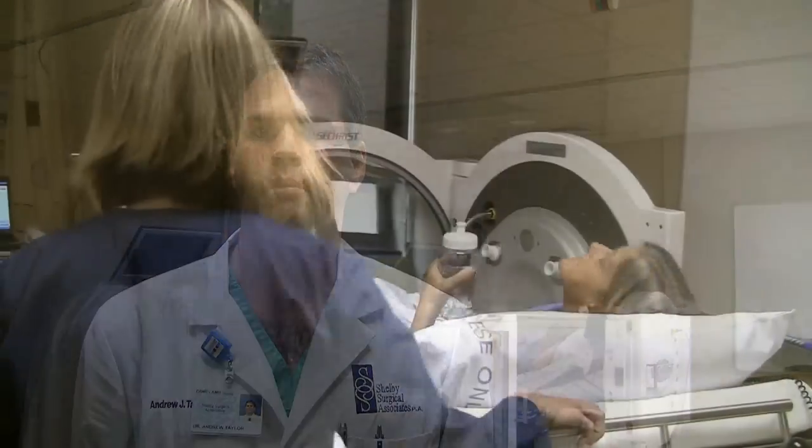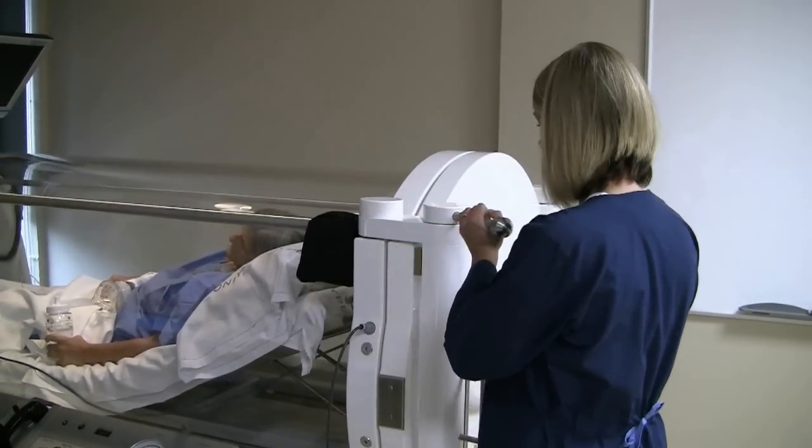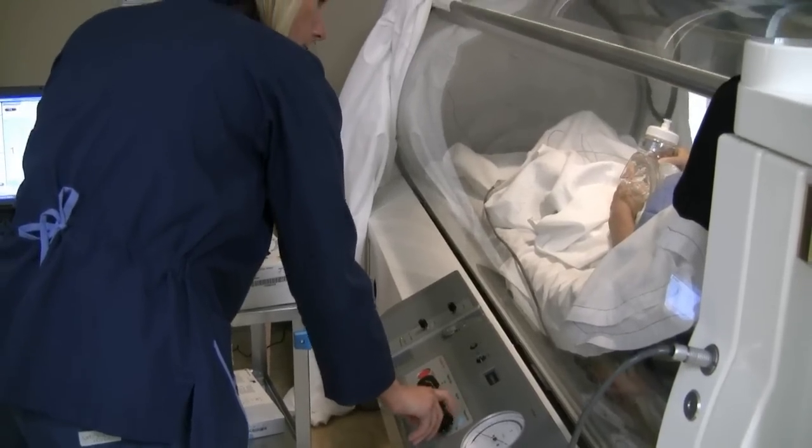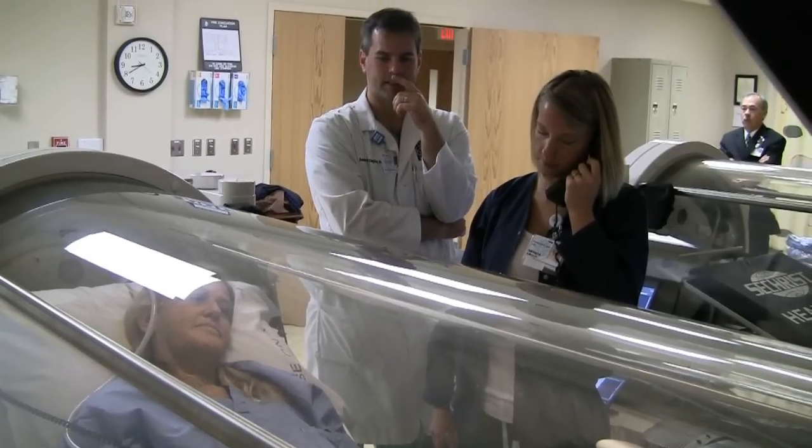She's relatively young and otherwise healthy, so we want to do everything we can to try to get this stump healed. The amputation was May 14th — a complication due to a slight infection that wouldn't heal. We placed her today in the hyperbaric oxygen chamber for the first time. My name is Manny Smith, I'm a certified hyperbaric technician here at Cleveland Regional Medical Center. We pressurize the chamber with a hundred percent oxygen, and it's good for wound healing — there are several different indications for this treatment.